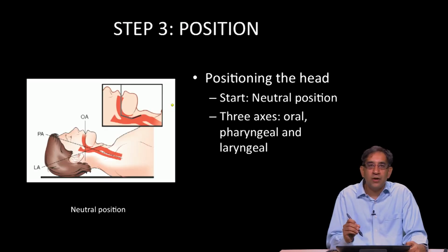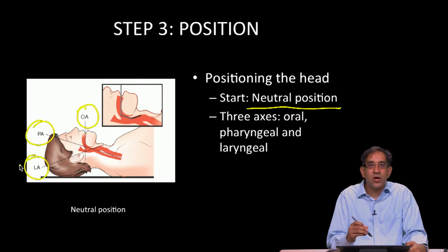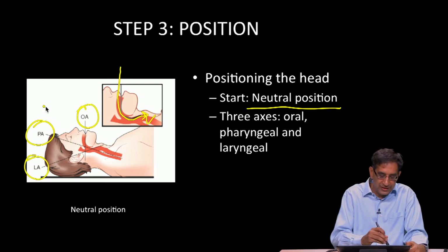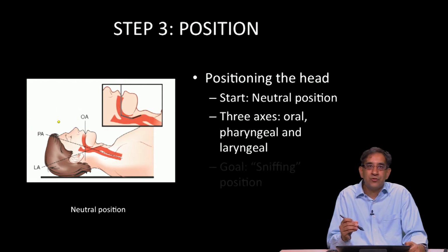Generally, when you start, the patient is in the neutral position. And when they're in the neutral position, there are 3 axes. The oral axis, pharyngeal axis, and laryngeal axis are all at angles to one another. And really, it's impossible to see the vocal cords. You'd have to see around this bend to see these vocal cords, which are located right here. Impossible. So your goal is to try and align these axes as best as you can so that you can see through the mouth and visualize the vocal cords before passing the endotracheal tube.